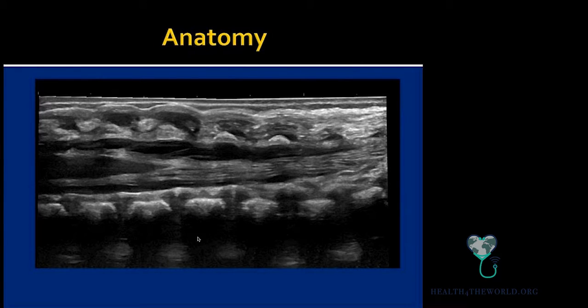First we'll talk about this in a moment. Anatomy overall. Let's go through some of the important anatomy first. The first one to turn up, that's S1. Then, okay, L2, there's L2. Right there at the very bottom of L2, L3, any lower than this is kind of my lower limit for calling it within range. This is at the L2-L3 junction. You really don't want it below this level.